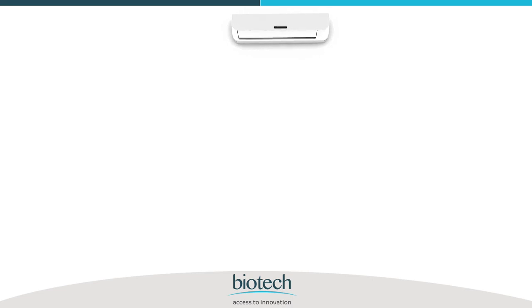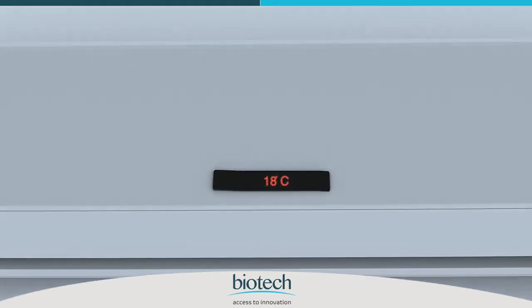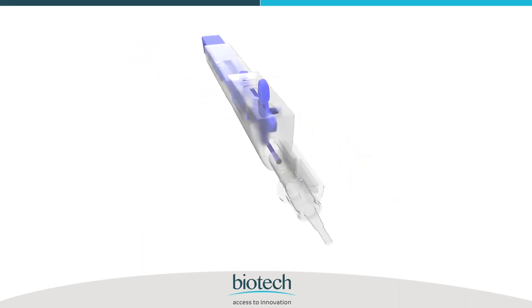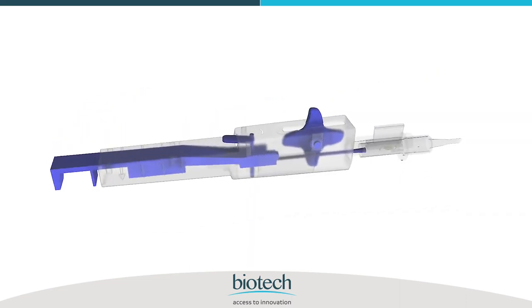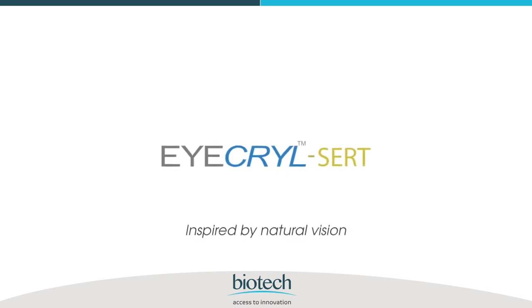For optimal results, it is recommended that the temperature of the operating room should be above 18 degrees centigrade and the lens is injected within three minutes of filling OVD into the system. Enjoy using iKryl CERT, the advanced monofocal hydrophobic IOL in preloaded delivery system, brought to you by Biotech Healthcare — iKryl CERT, inspired by natural vision.